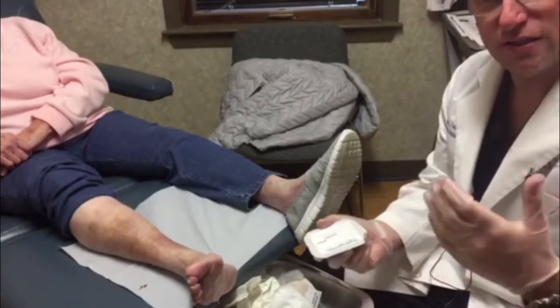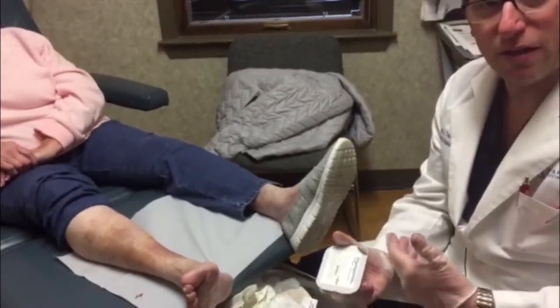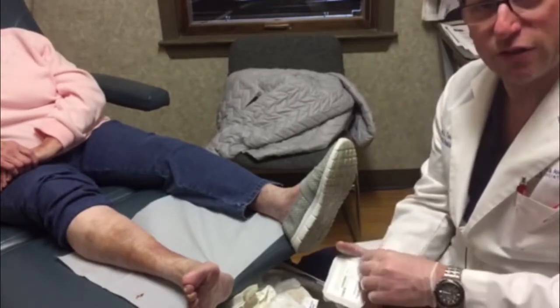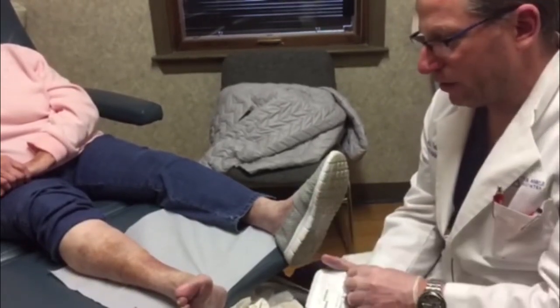PA Foot and Ankle Associates is known for the extensive research that we do with wound care and using these amniotic tissues in helping patients heal a lot faster. So again today we're going to be applying this amniotic tissue on this patient.